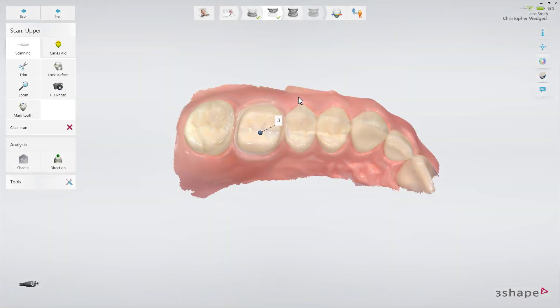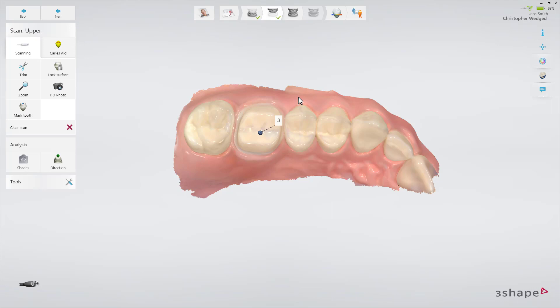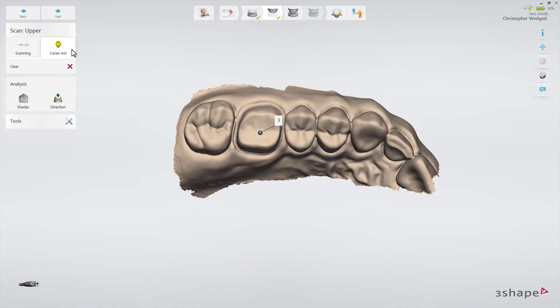When the regular scanning is finished, the Caries Aid button becomes available, enabling fluorescent scanning for aiding the detection of possible surface caries. Press the button to activate fluorescent scanning and start scanning once again. In this video, we focus on a single crown already verified and prepared for the restoration, and we will not proceed with fluorescent scanning.